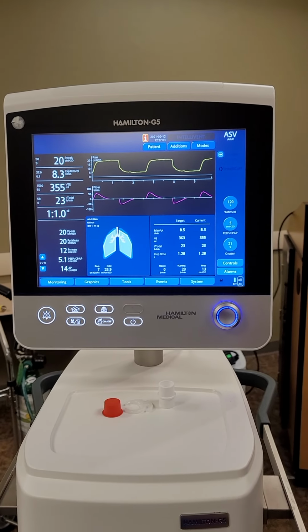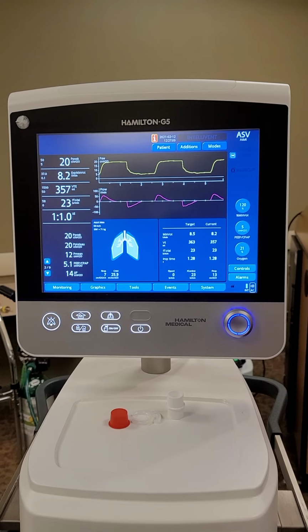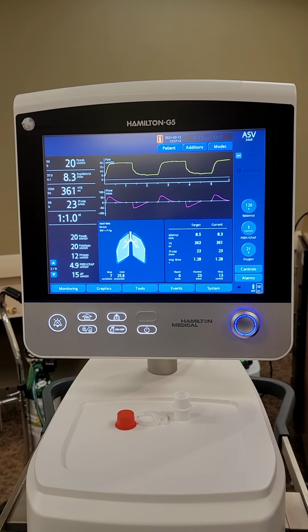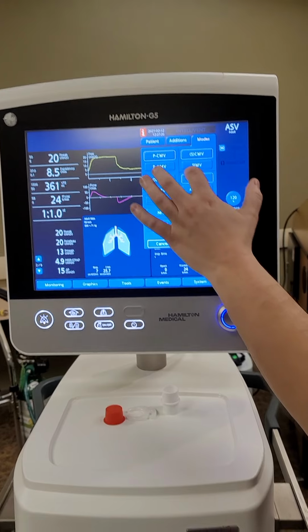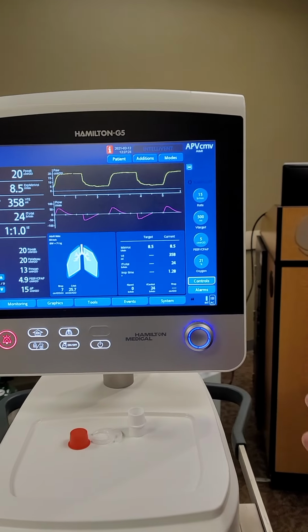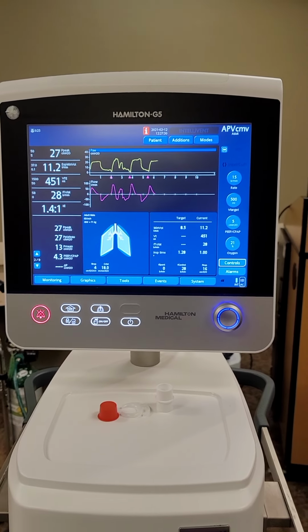Is this something where you come in and the patient is dyssynchronous with the vent, but they're not necessarily in full-blown ARDS on 100% and 20 of PEEP or something? I think ASV is a mode to try, yes. Mm-hmm. Yep. And if we were in, let's just say we were in APV, just to make it easy. Okay, this is the mode we're in. Your patient is breathing pretty heavily here.